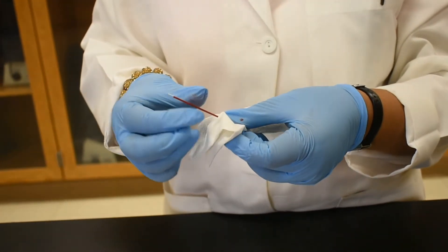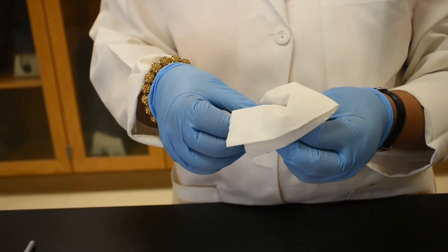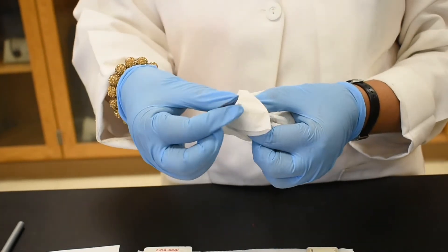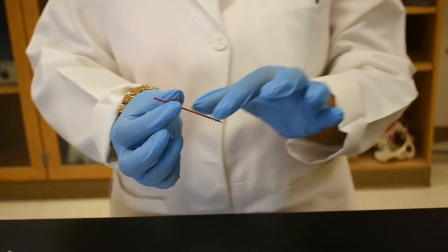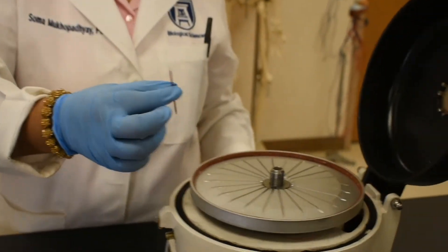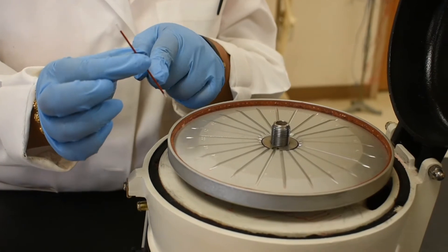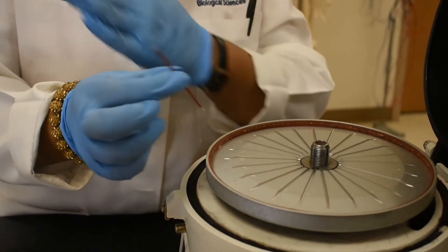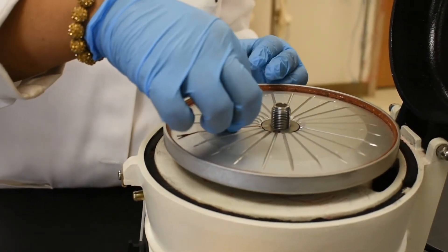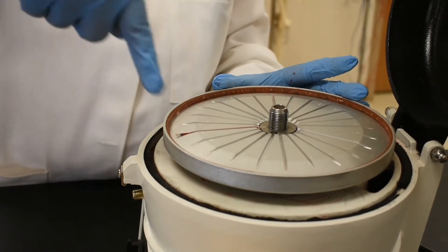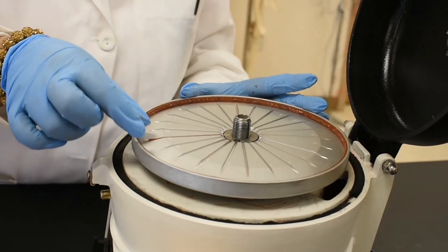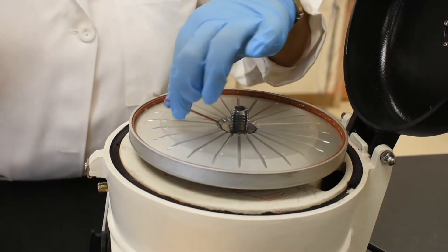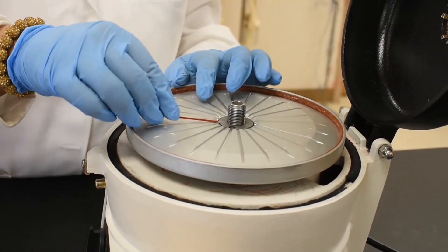Always make sure to wipe it thoroughly but gently because these are very thin capillaries. And now we will load the capillary tube in the centrifuge with the sealant side towards outside. Because when this is rotating, if you have the tube loaded in the reverse direction, all the blood sample will be spilled out of your tube.